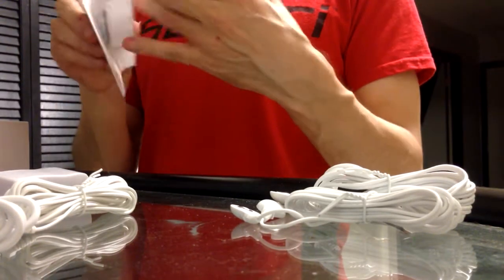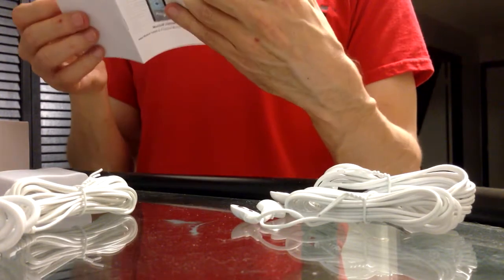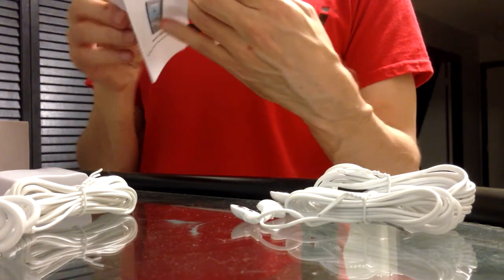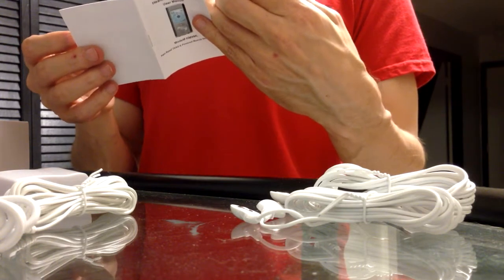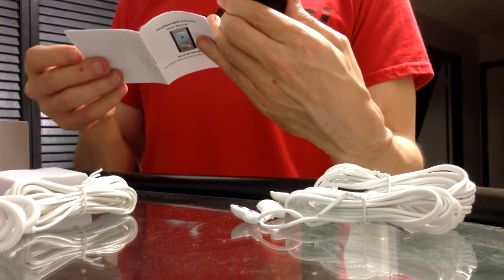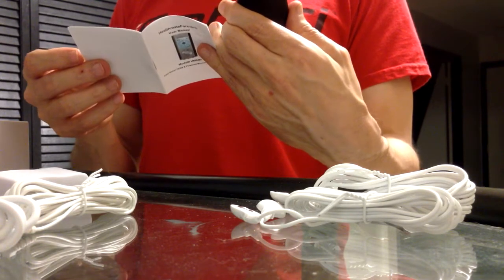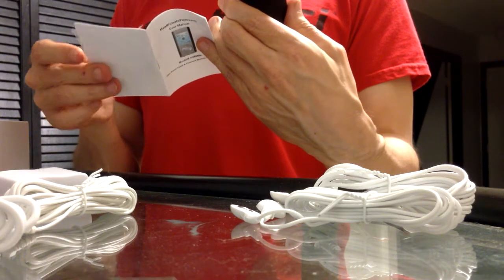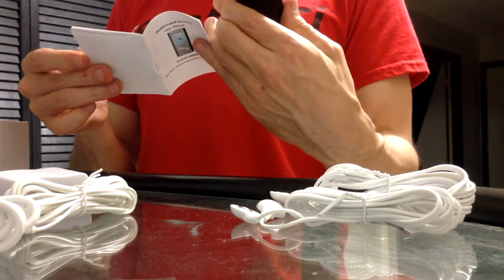I want to put the book back in — there better be instructions here. Here it is, here's a little booklet. This is probably where it gets interesting. I can't read it — it's so tiny and bright. Let's see: time indicator, USB port, blah blah. There's an A output and a B output — timing button, intensity button, okay.